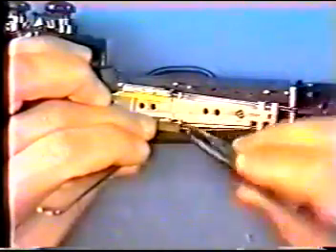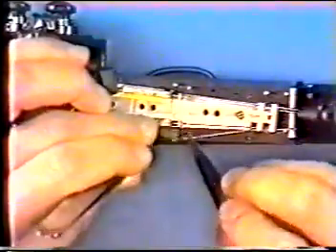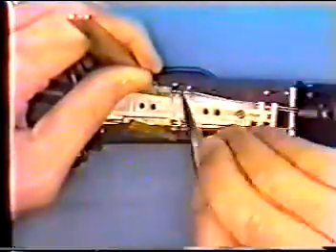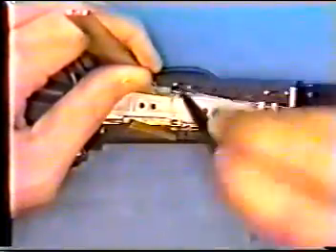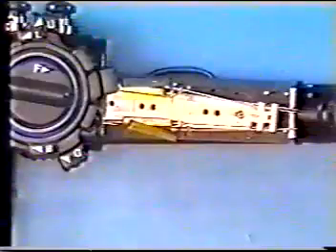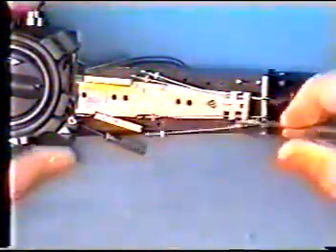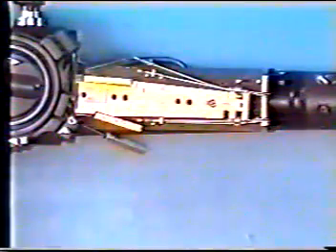Disconnect the angulation wires, which are screwed into sleeves. Please do not pull the sleeves out too much, or they may get chinked. Pull out 4 angulation wires from the groove of guide. Be careful not to chink the wires.